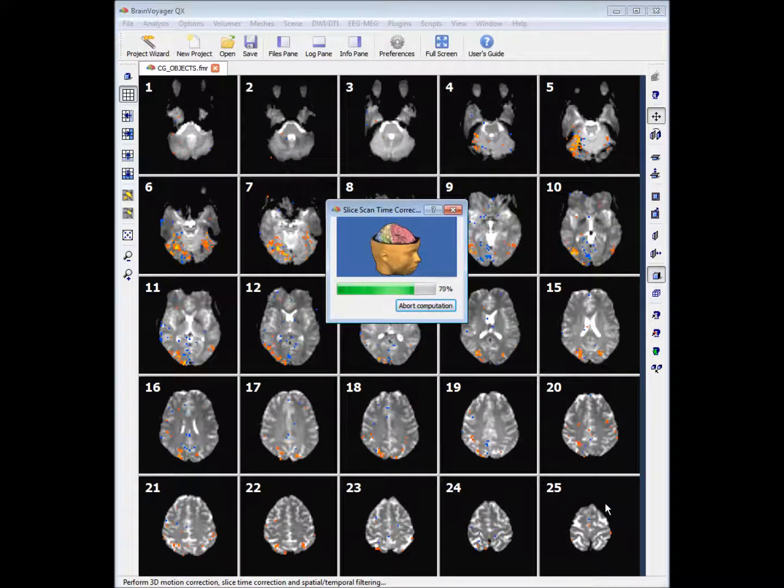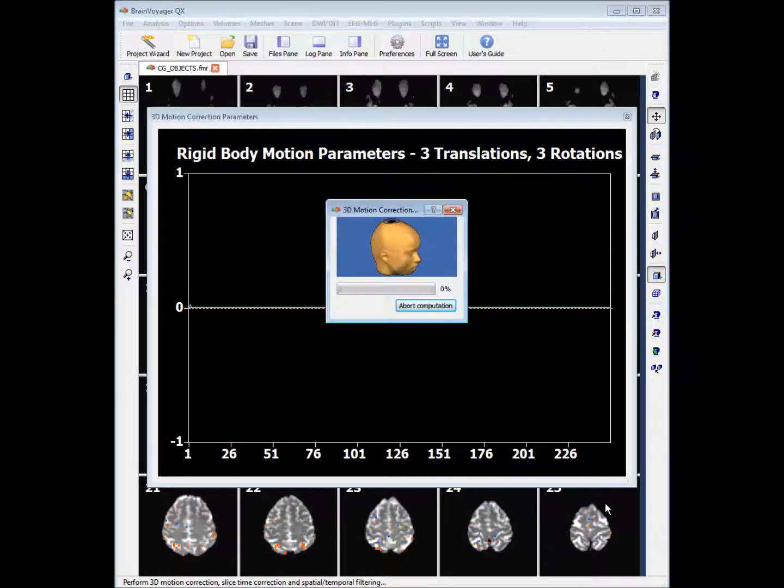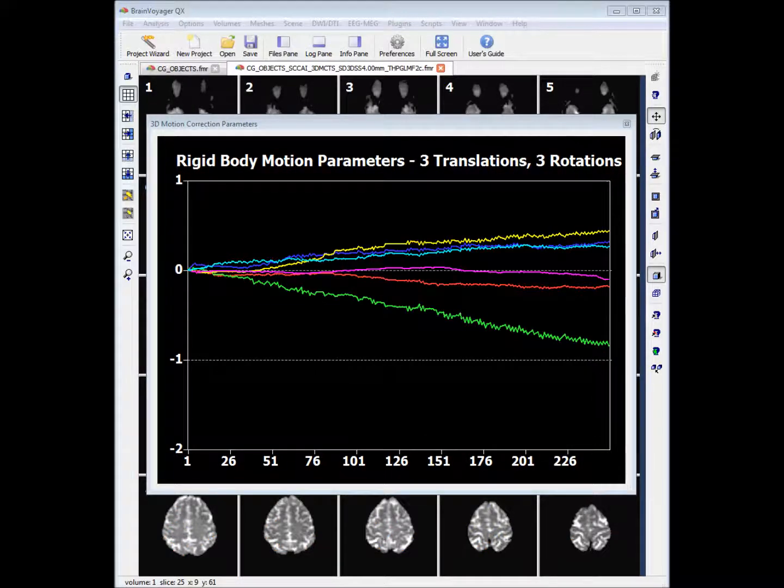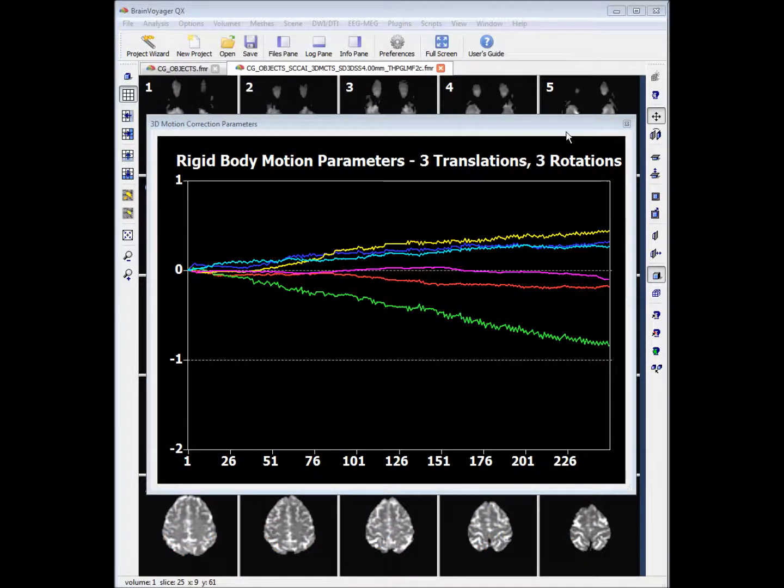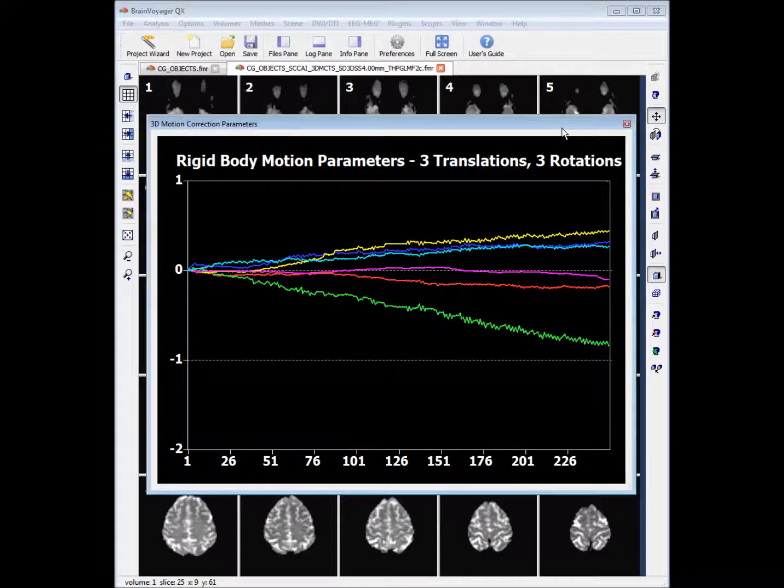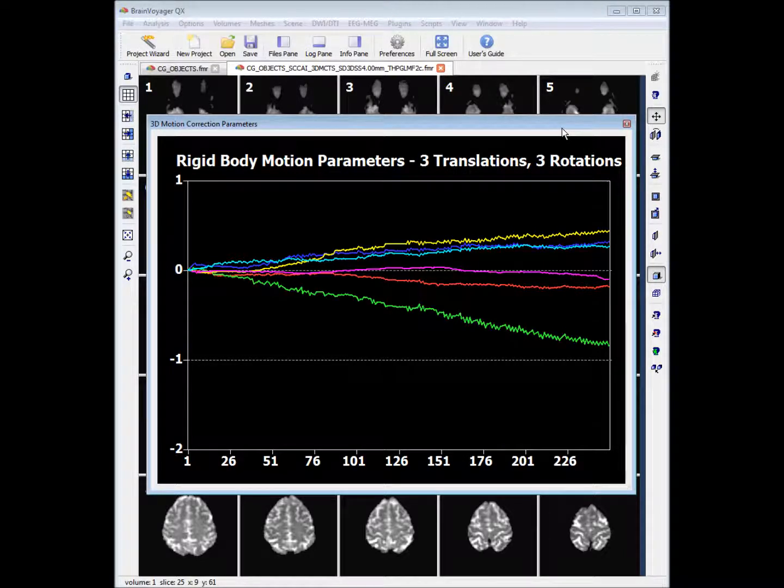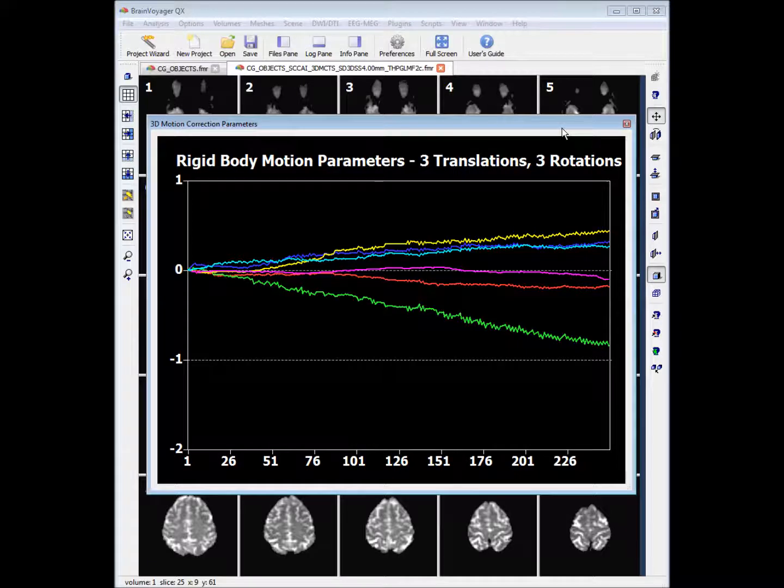Now what you'll find is Brain Voyager will work through these steps consecutively. Once the pre-processing steps are complete, a video will play showing you the head motion correction. You'll have this motion correction graph here indicating how much head motion correction was done.